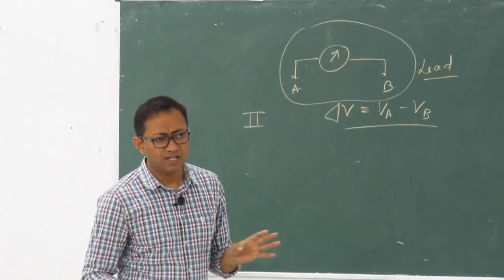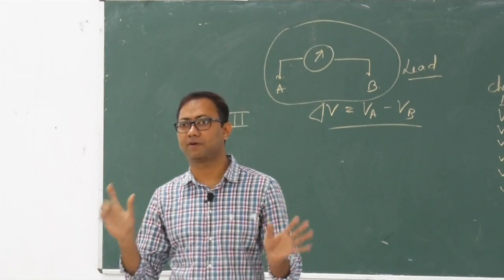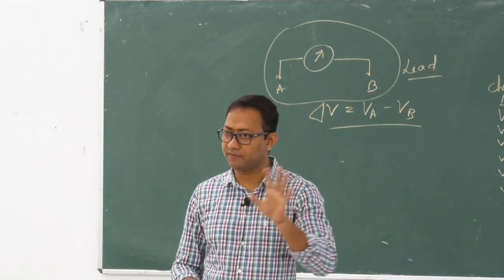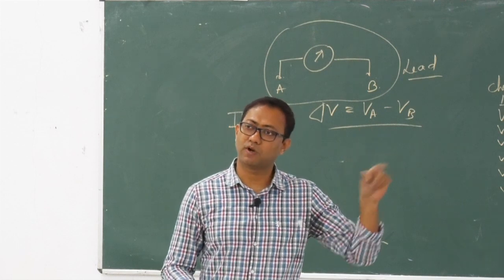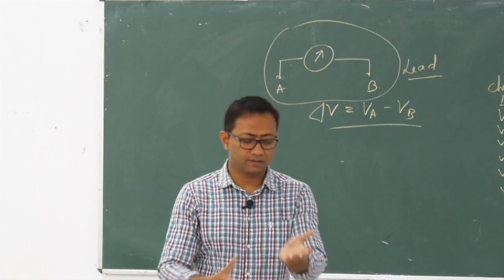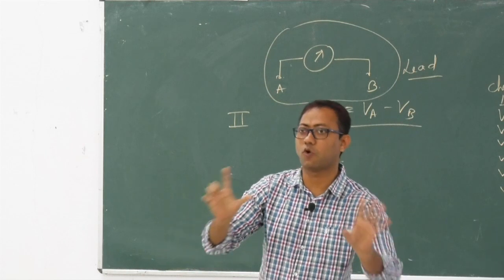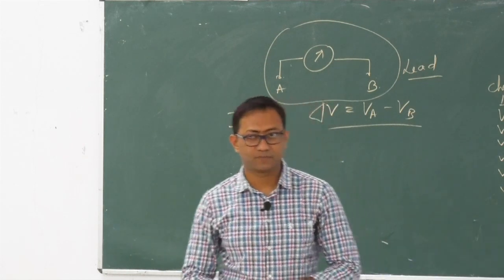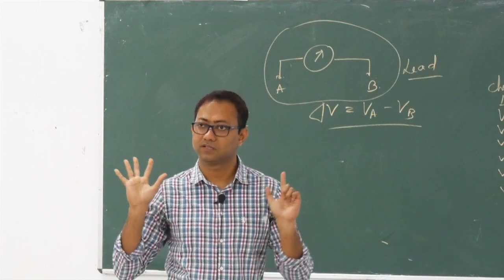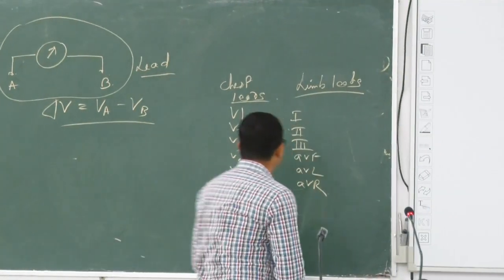Very rarely we perform a 15 lead ECG, but commonly we perform a 12 lead ECG. Of these 12 leads, 1, 2, 3, aVF, aVL, aVR are limb leads, and V1 to V6 are chest leads. You have seen an ECG: we put leads over the limbs, and the leads we apply over the chest wall are called chest leads.